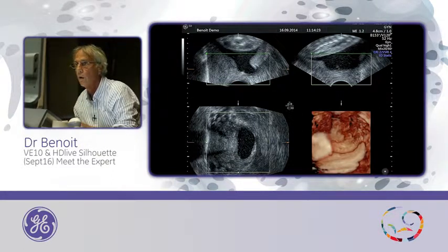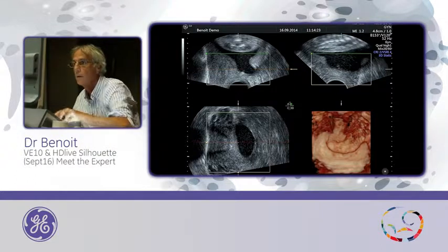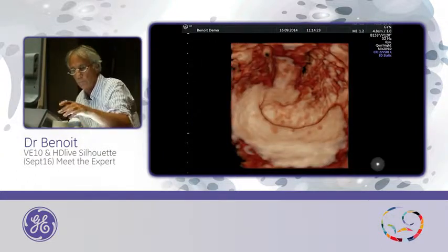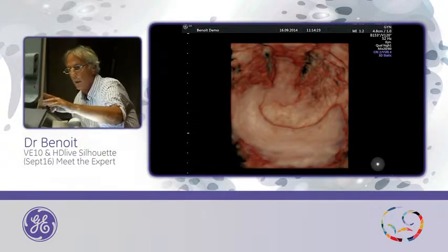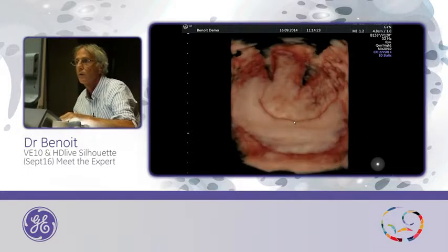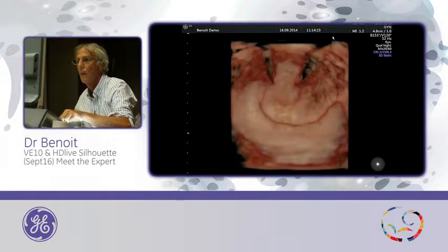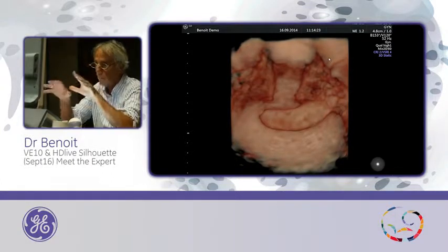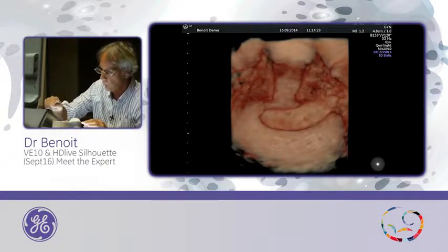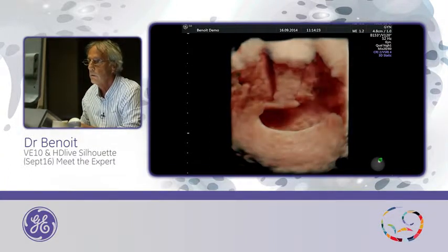Okay, the green line is not in the correct position, so I will move to the upper position, rotate, and with a magic cut I will clean this part, and this is a view of this from inside the uterus.